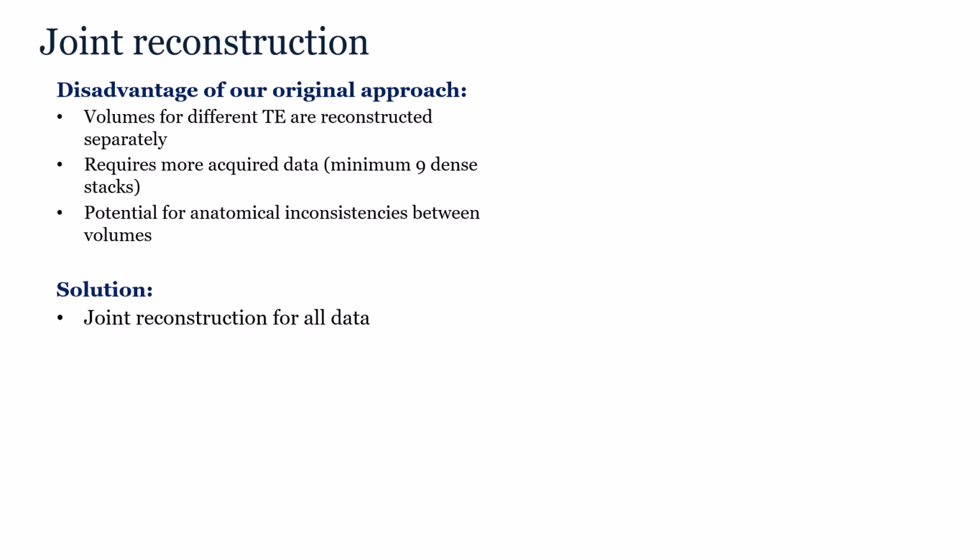The disadvantage of our previous approach is that it reconstructs volumes for different echo times separately. As a result, we require enough data for good quality reconstruction for each individual echo time. There is also potential for anatomical inconsistencies between reconstructed volumes for different echo times. In this abstract, we therefore propose a joint reconstruction of all data with all different echo times.